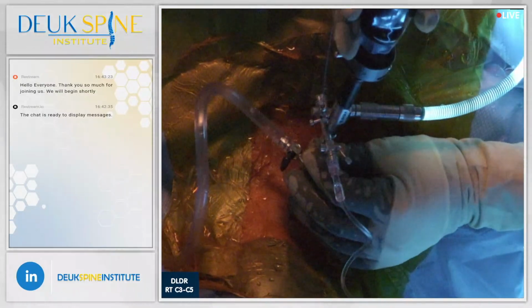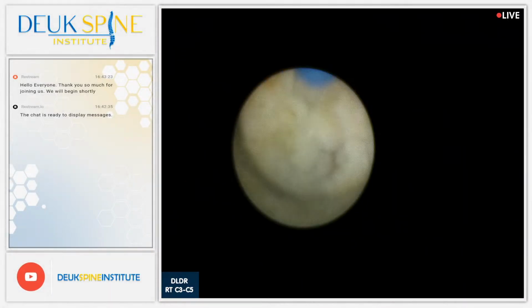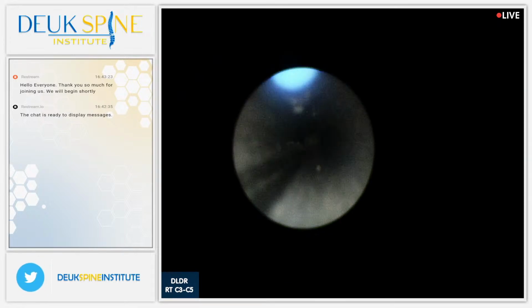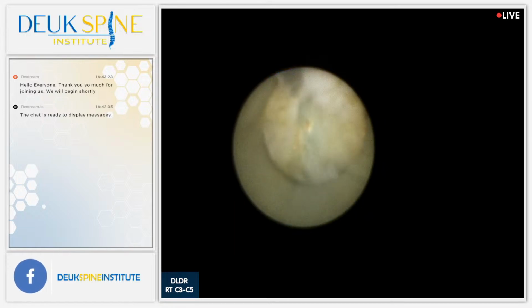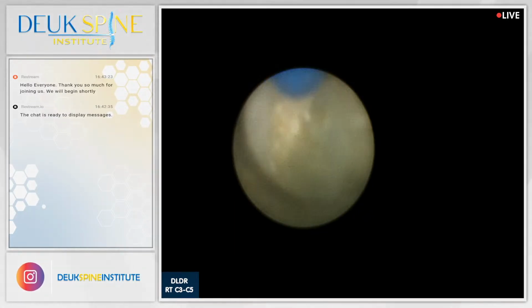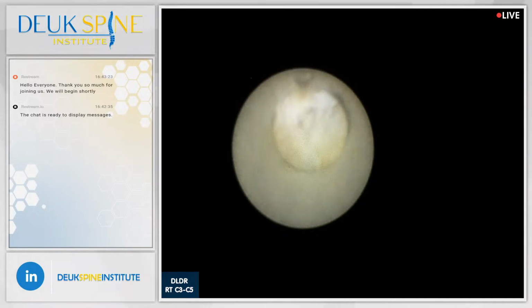I was a little worried about this one because it's so much herniation. What I mean by that is, it's not that it's so much herniation I can't get all the pieces out. What I mean is, it's so much herniation, is the disc going to be able to heal properly? Or is it going to be incompetent and re-injure again?